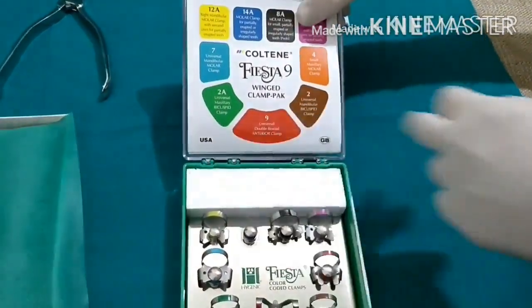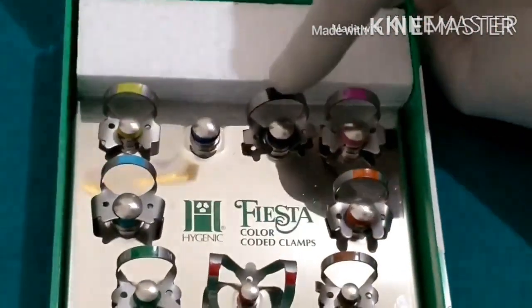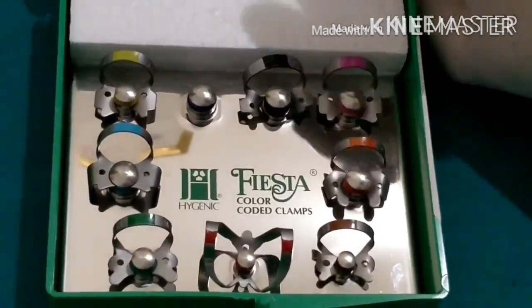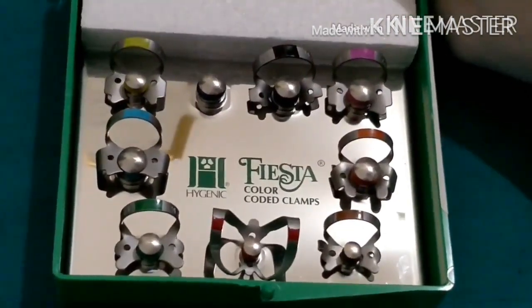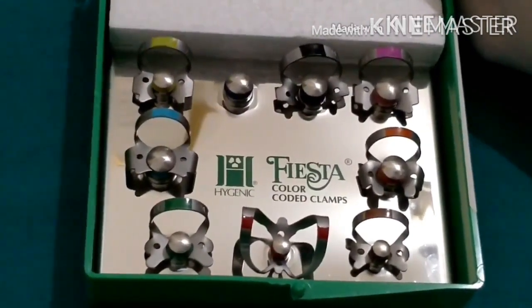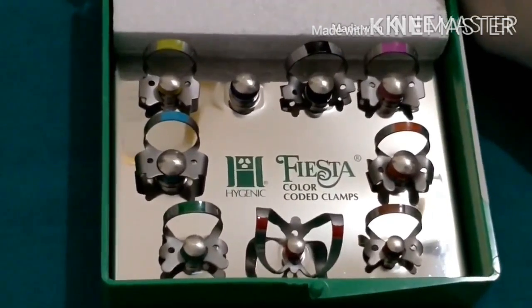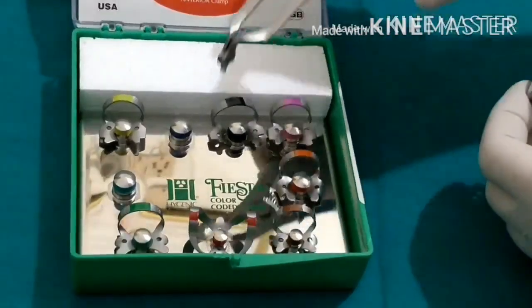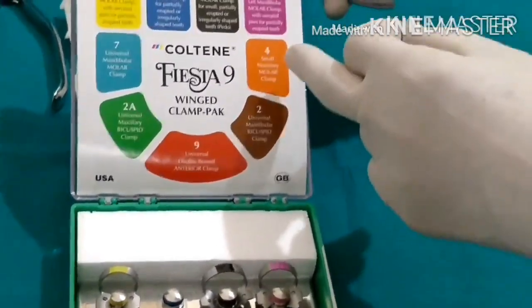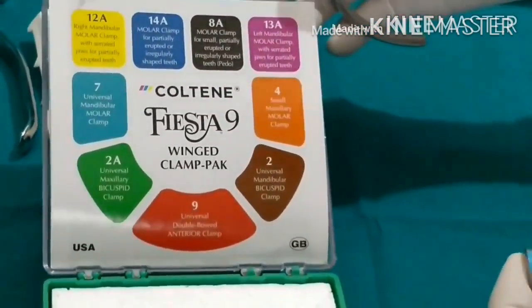This is a hygienic quality kit from the USA. All the clamps are color coded, and the function of each is written indicating where they can be applied. In the beginning you have to look at each one carefully, and slowly you will come to know which is which — eventually you can just pick it up by seeing the nature of the clamp. All clamps are numbered and under each is written for which tooth it can be used. We'll take up one clamp and I'll explain how it works.